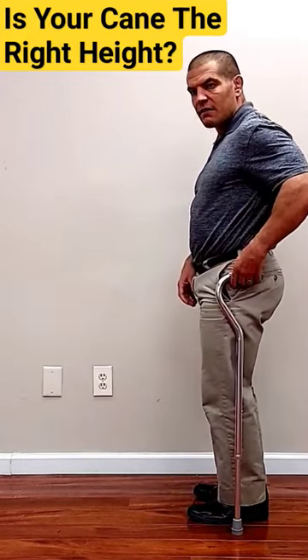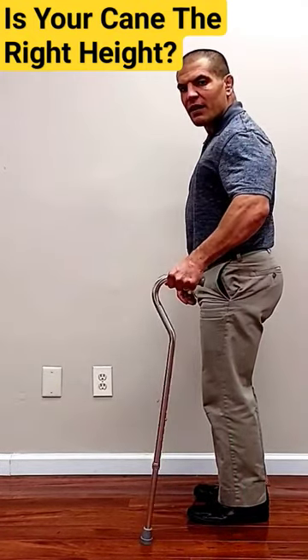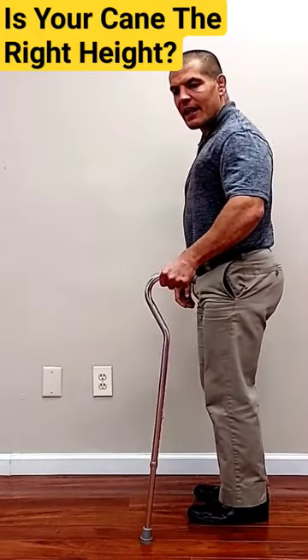If I put this here, this is just a little bit above that, but you can see my elbow is probably a little more bent than I would ideally like it.